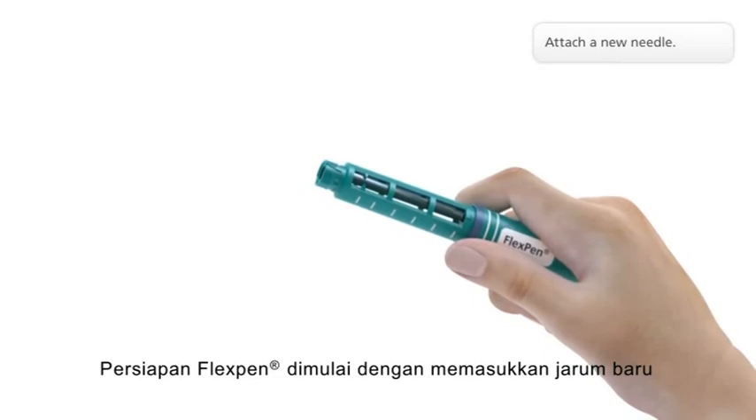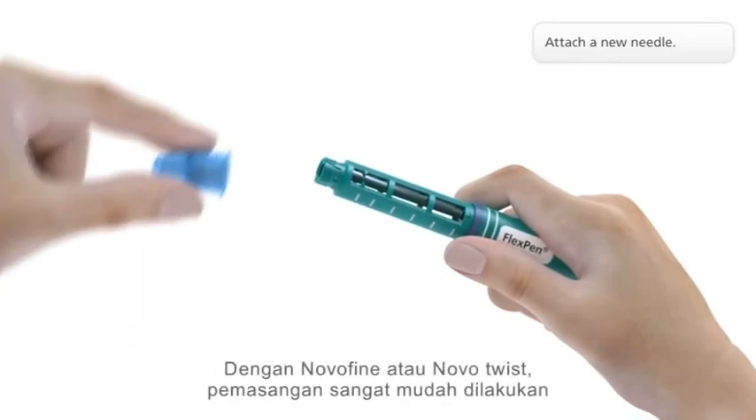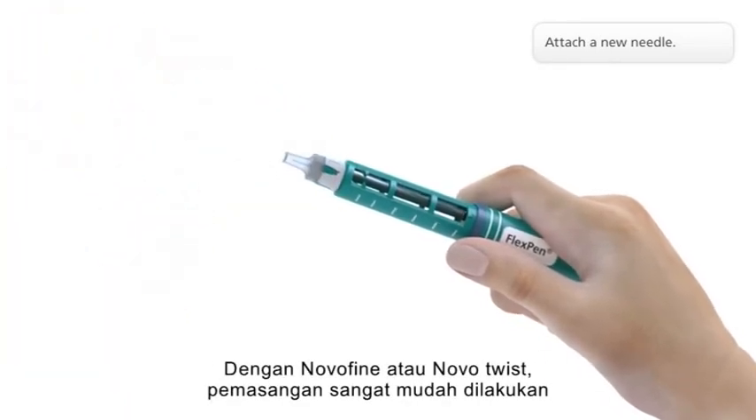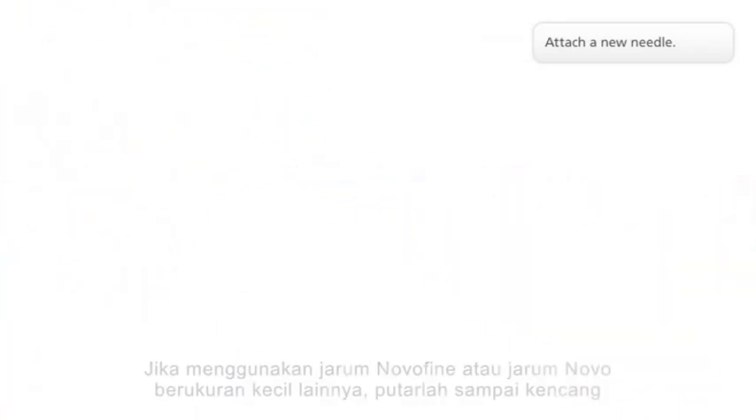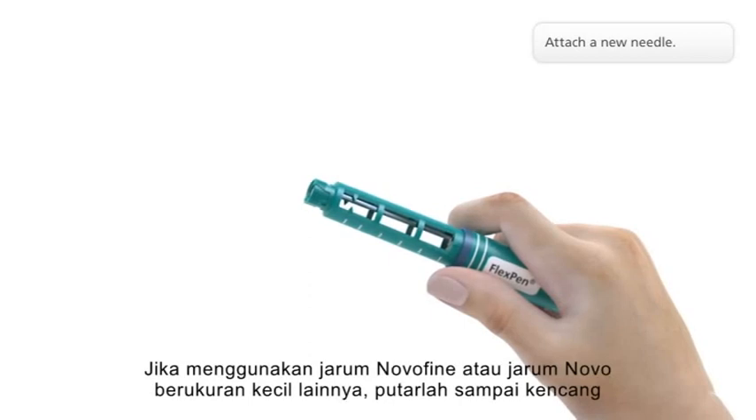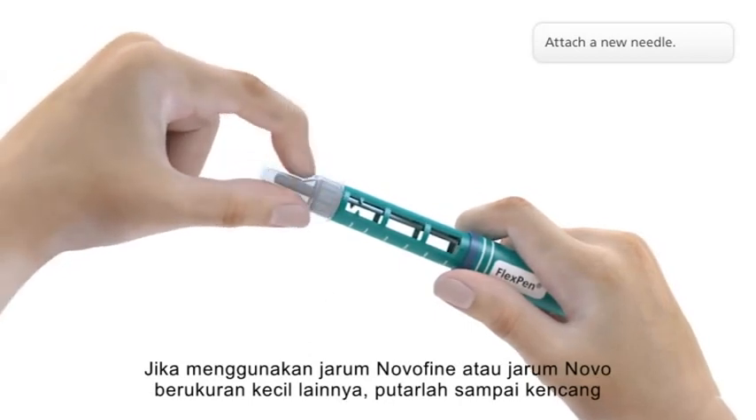To prepare FlexPen, attach a new needle. With NovoTwist, it's a simple one-twist attachment. If using a NovoFine needle, screw it straight and tightly onto the pen.